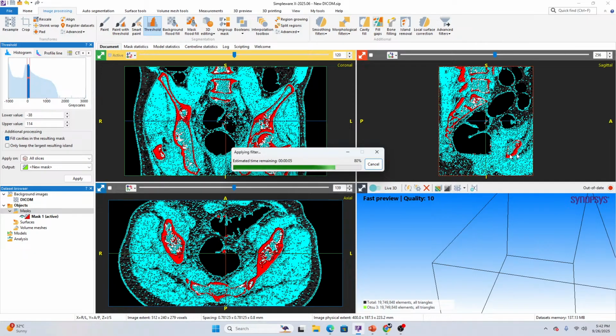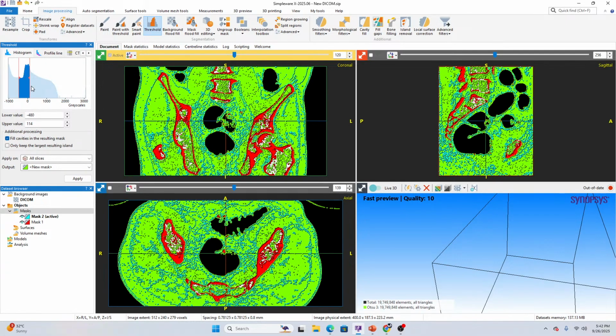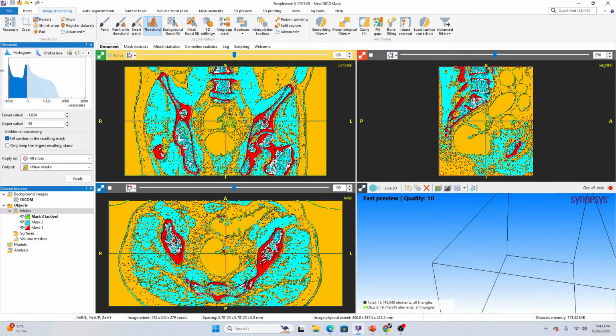And for example, if we need to check out the airway, then we further reduce it over here, checking another grayscale range and setting it up. This way, different regions can be identified on the basis of peak range. Once it is done, we can move to the last part to carry out the distinct region. Earlier in the same dataset, the distinct region wasn't very visible.